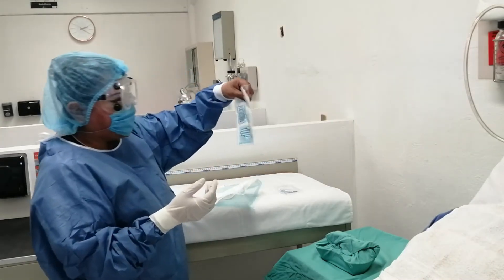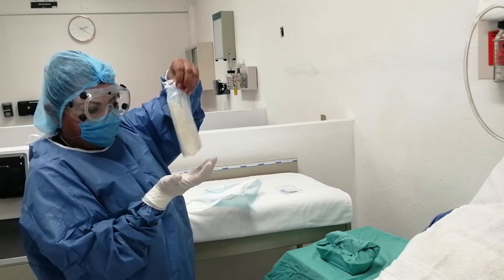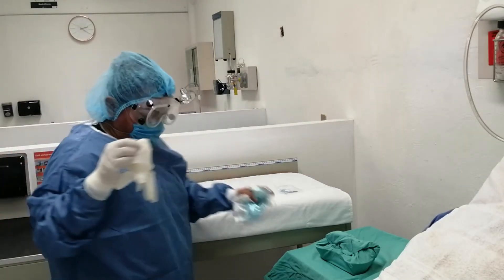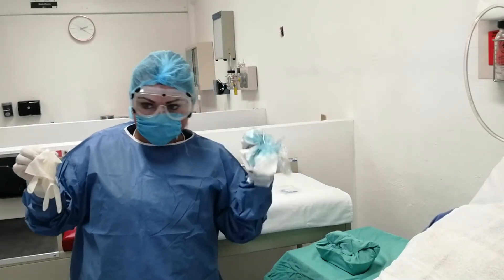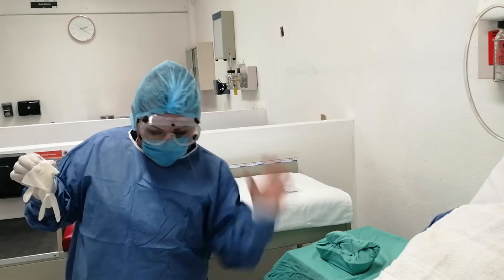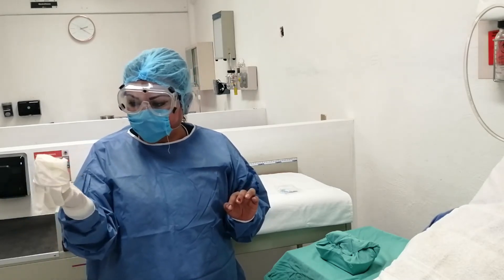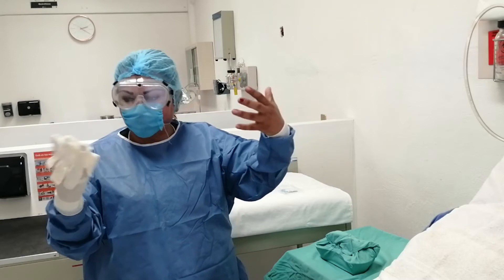Dejamos caer el guante con mucho cuidado. La basura — la envoltura — va al bote negro o bolsa negra, ya que no tiene contacto con el paciente. Nos preparamos el otro guante para calzárnoslo. Lo tomamos de manera que lo estéril esté con lo estéril, sin tocar la parte que va en contacto con la mano.